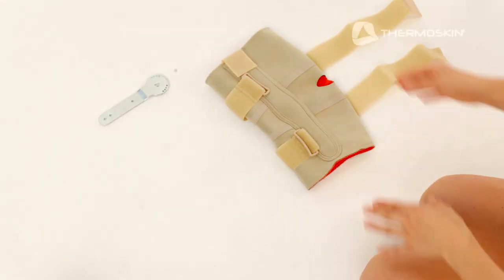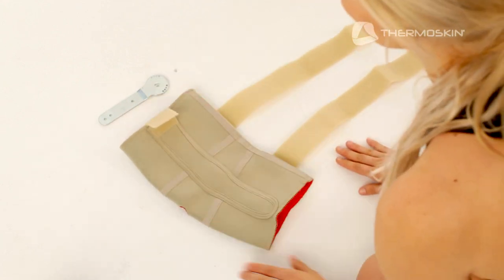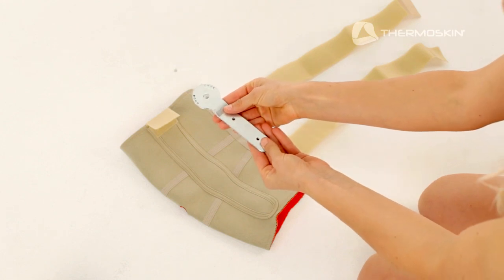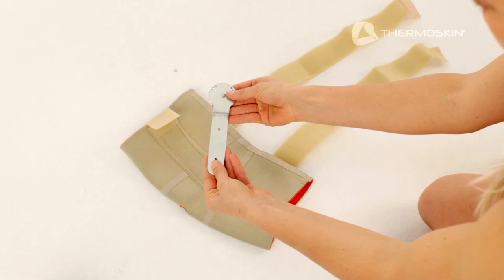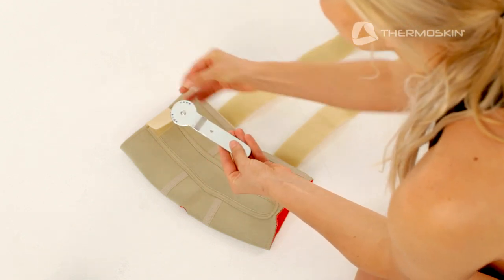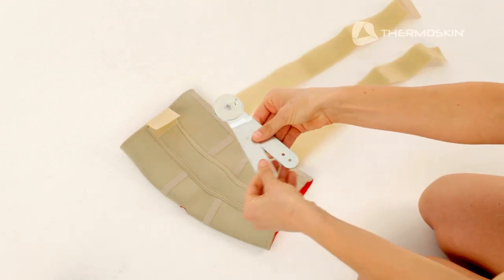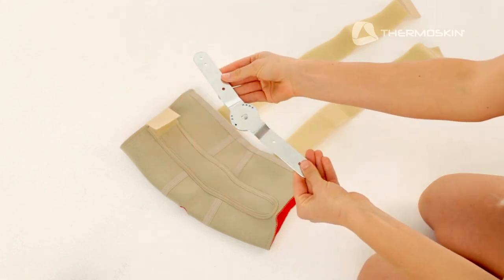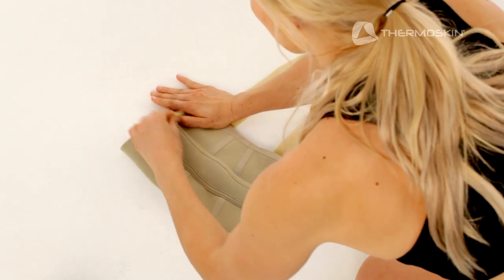To fit the knee brace, undo all the fastener straps ready to insert the hinges you have chosen to purchase. For the purpose of this video, we will use the Range of Motion Hinge. Range of Motion Hinges need to be set to the required degree of movement before inserting them into the brace — either 0, 15, 30, or 45 degrees. To do this, simply position the removable pin in the required degree of movement. Set both the right and left hinges to the same degree and insert them into the side pockets of the brace, securing the short fastener straps at the top to keep them in place.